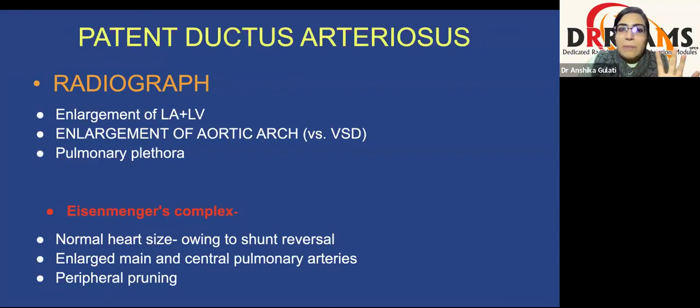And in PDA cases, the radiograph will look just like VSD, except that there will be enlargement of the aorta as well. That is the differentiating feature between VSD and PDA on radiograph.